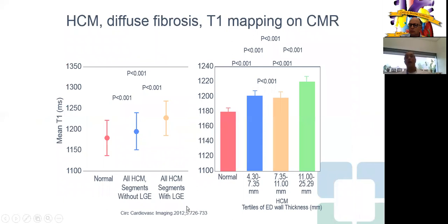Something cool. T1 mapping, which assesses diffuse myocardial fibrosis, can be measured on CMR, and lots of work is being done showing differences in T1 mapping, T1 times in different phenotypes of HCM, as well as hypertensive heart, etc. Prognostic value of this data should be coming with the HCMR trial that is in the analysis phase as we speak.